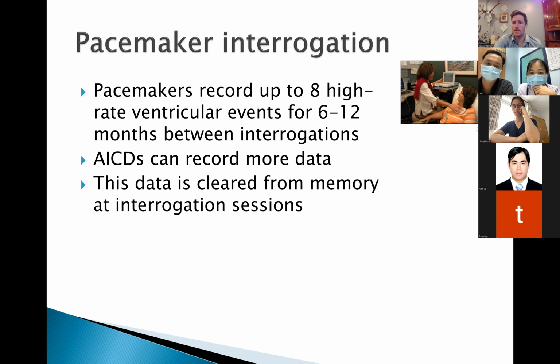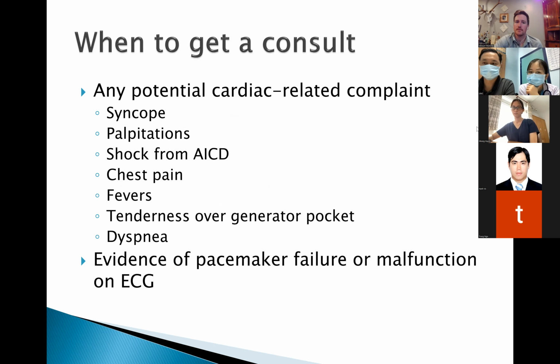Yeah. So with pacemaker interrogation, pacemakers record up to 8 high rate ventricular events for 6 to 12 months. And then the AICDs can also record this data, but they record a lot more. And usually when they interrogate it, they'll clear the memory at each interrogation session. So if they interrogate it and they see, oh, look, we had maybe a couple runs of VTAC or something like that, then they'll erase that for the next session.